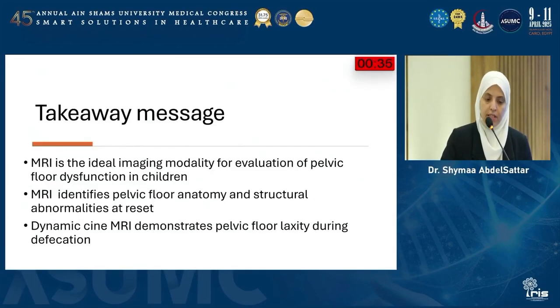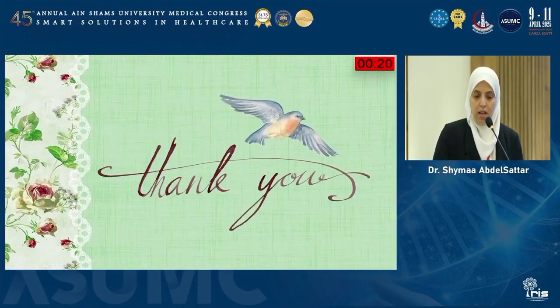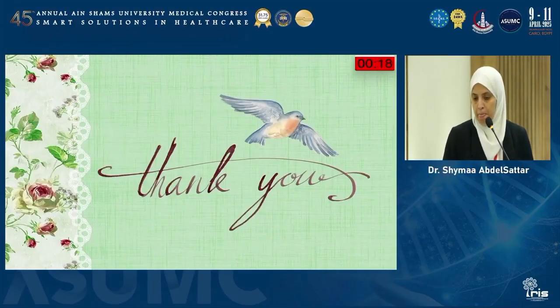These are my references. Takeaway message: MRI is the ideal imaging modality for evaluation of pelvic floor dysfunction in children. MRI identifies pelvic floor anatomy and structural abnormalities at rest. Also, dynamic cine MRI demonstrates pelvic floor laxity during defecation and functional abnormalities. Thank you very much.